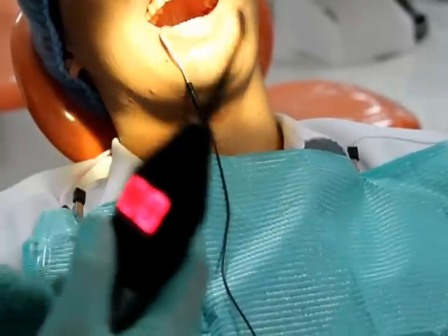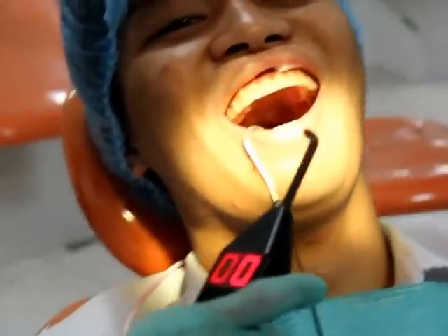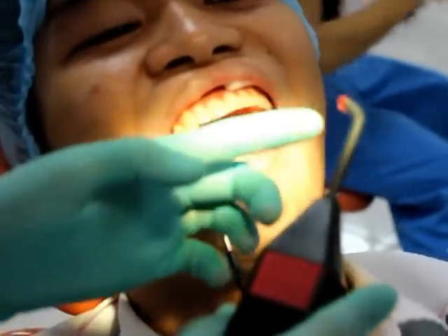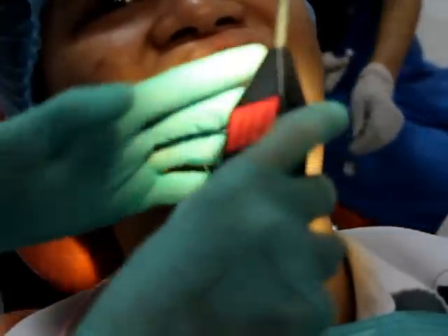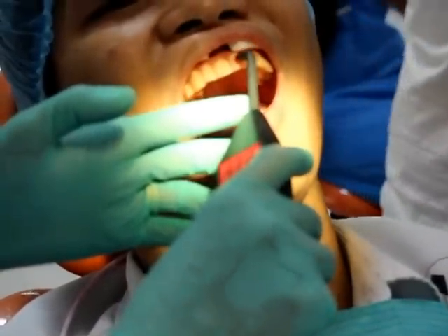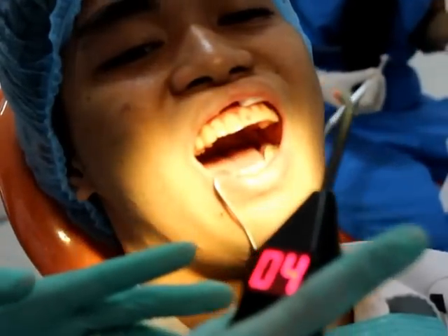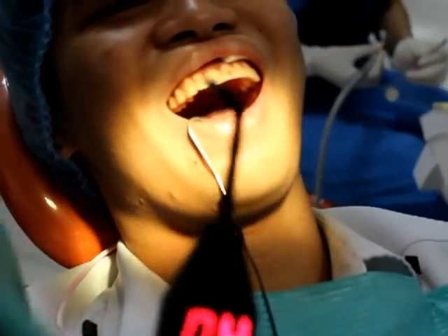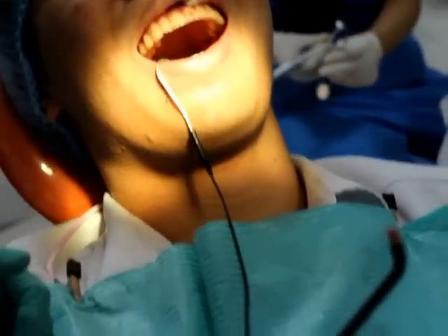So let's start from 0. Okay. So you have the conductor. Clean, dry, isolate. Place it on the tooth, just at the middle. And then start. See? It's 4. So that's the reading. 4. So what's your interpretation? The tooth is vital.